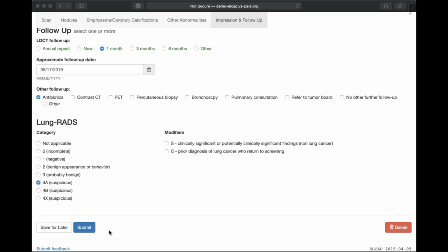If the intake form is put into VistA and it's a specific note title, the note title can be configured to send a notification to a particular service like radiology. So it could be easily done in VistA, although I don't know how it could be done in the actual I-ELCAP VAPAL software. Okay, thank you, Matt.